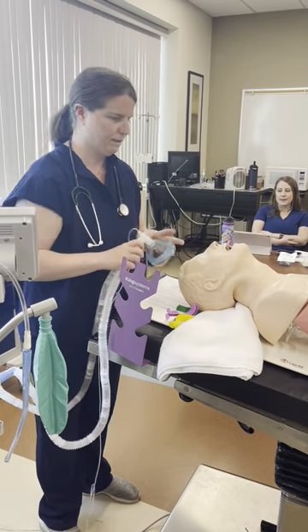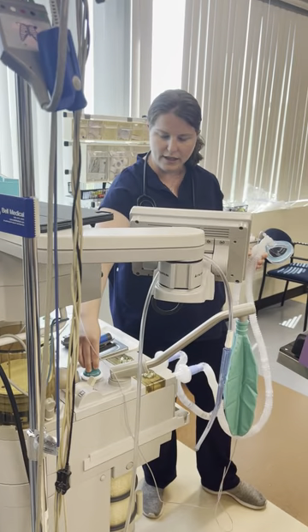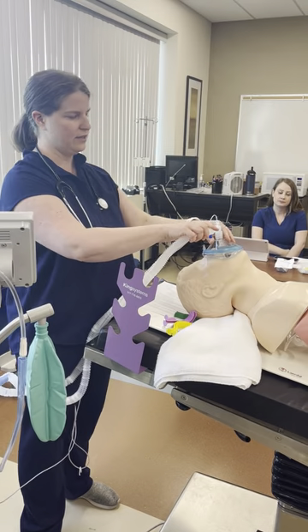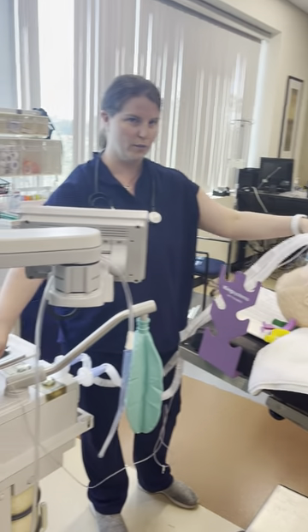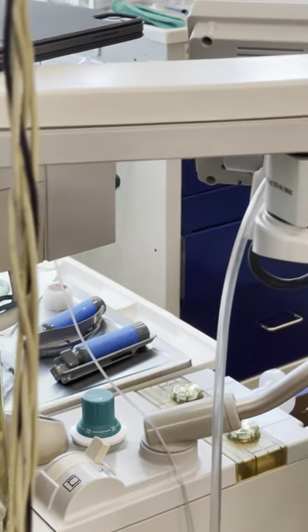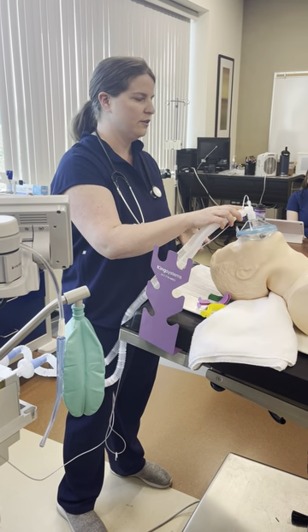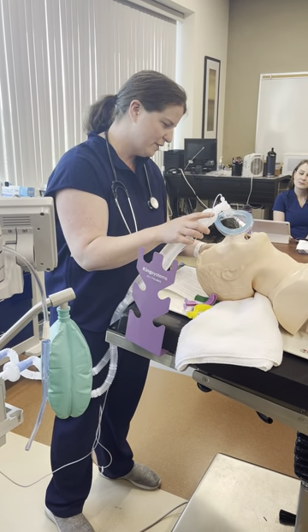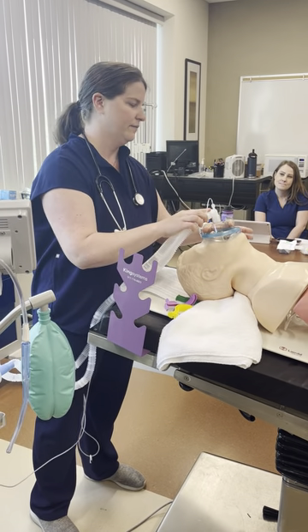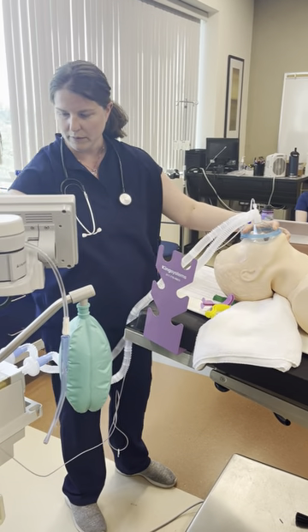The machine is on, we've got high flows of gas. During pre-oxygenation, the circulator holds a firm seal and the APL is wide open. After induction and pushing the paralytic, it's time to manage the airway — tap the patient, check responsiveness, check the eye reflex, tape the eyes, and now comes mask ventilation, so close the APL.